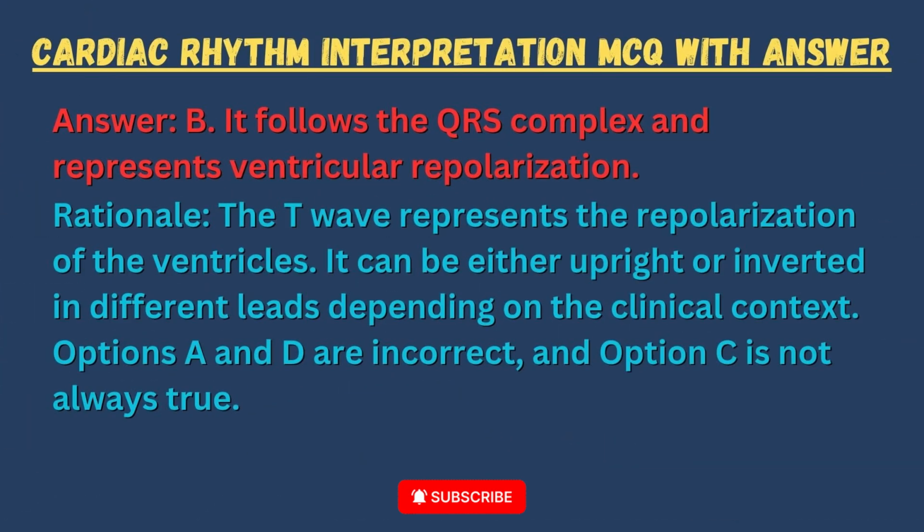Answer: B. It follows the QRS complex and represents ventricular repolarization. Rationale: the T wave represents the repolarization of the ventricles. It can be either upright or inverted in different leads depending on the clinical context. Options A and D are incorrect, and Option C is not always true.